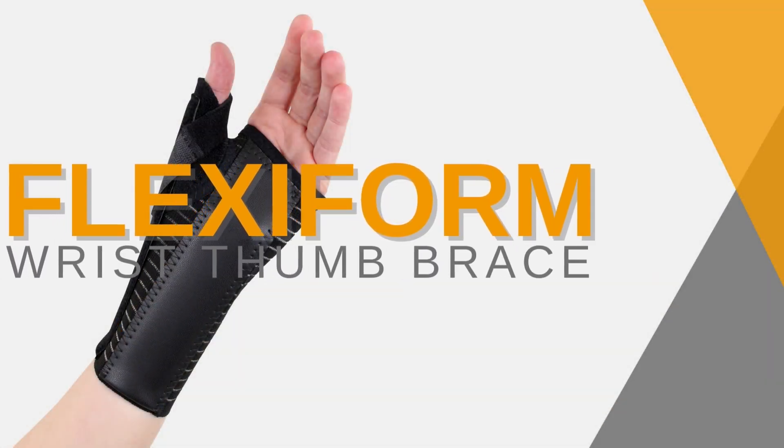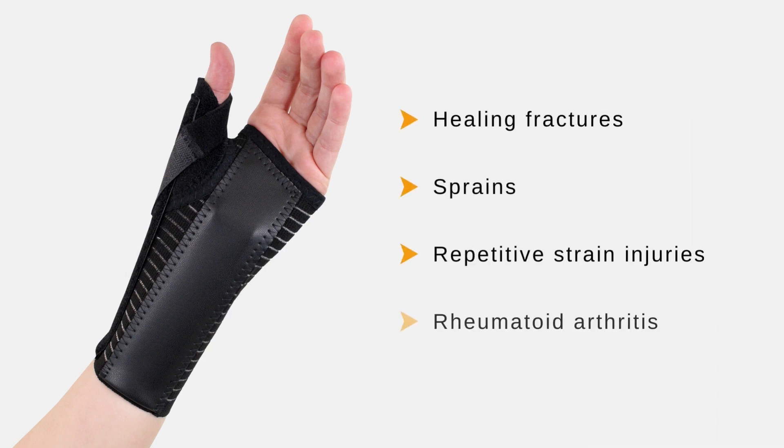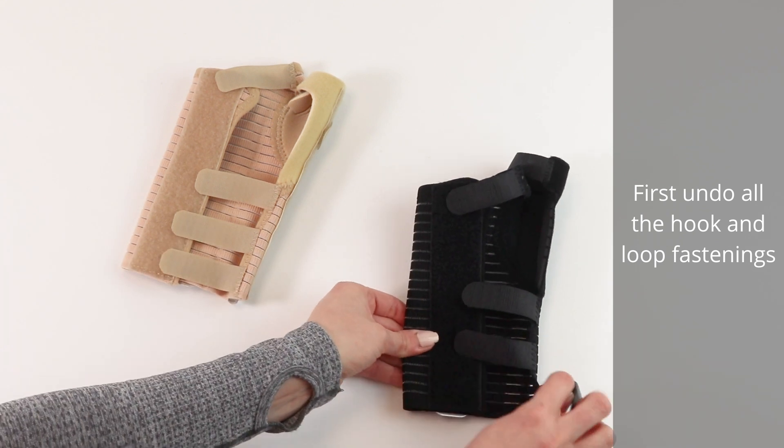Flexiform wrist thumb brace — for healing fractures, sprains, repetitive strain injuries, and rheumatoid arthritis. First, undo all the hook and loop fastenings.